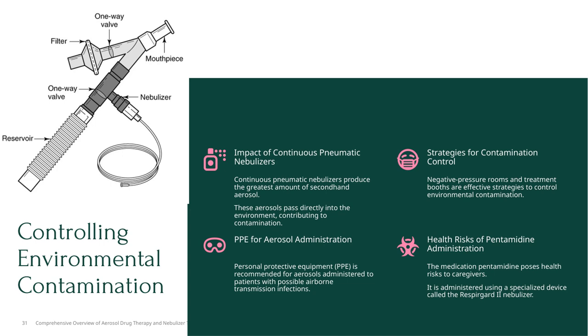For aerosols that could be airborne and pose a risk of transmission, wearing appropriate PPE is essential. It helps protect healthcare providers from inhaling harmful aerosols and minimizes the risk of infection. In summary, controlling environmental contamination involves using proper room setups, understanding the risks associated with certain nebulizers and medications, and always ensuring that PPE is worn when administering potentially infectious aerosols. These measures are critical parts of safe and effective aerosol therapy.